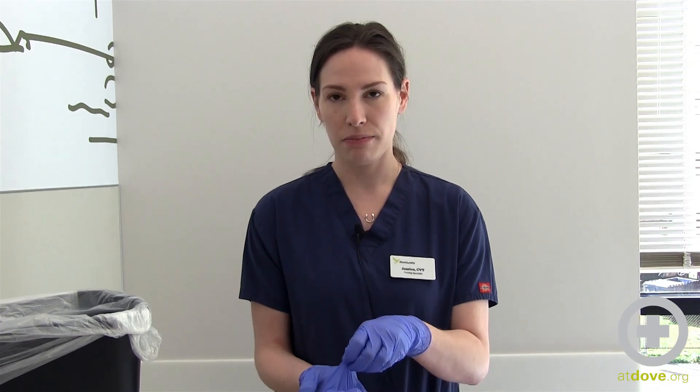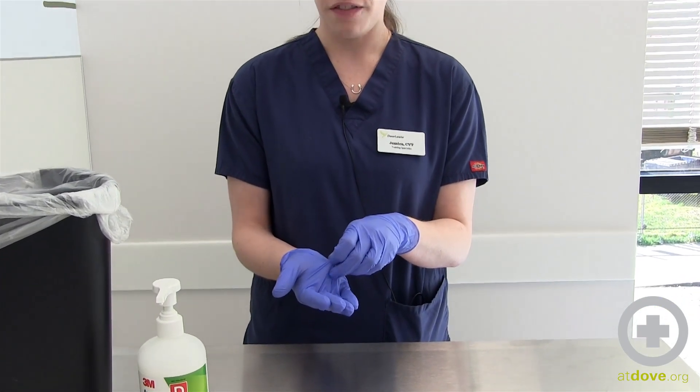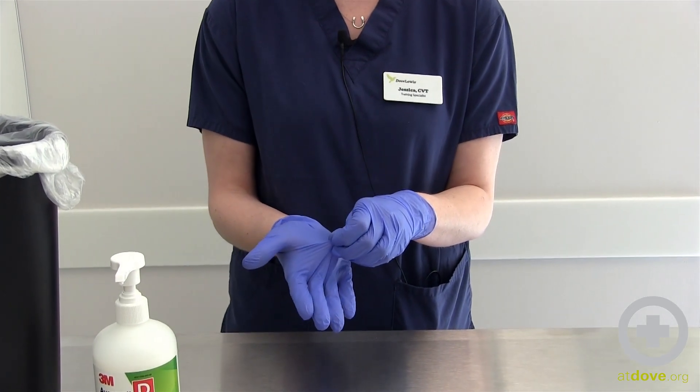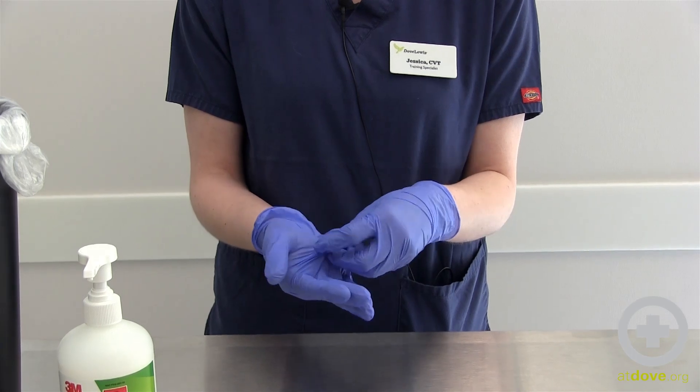First, you want to start by tenting your glove, pulling up in the center of your palm. Be careful not to pull too hard or too fast because you could rip your glove. If you do accidentally rip your glove or touch any contaminated area, make sure that you wash your hands immediately or use an alcohol-based hand sanitizer.